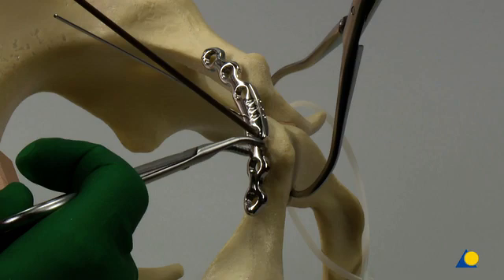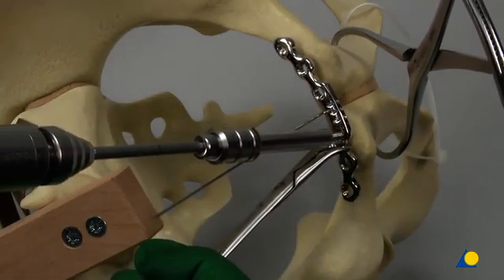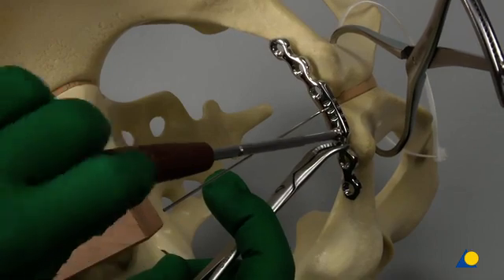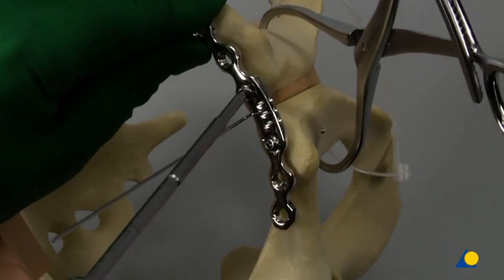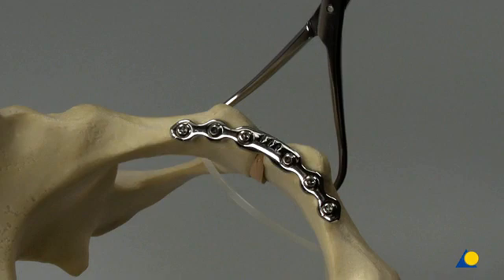In the frontal plane, the screw is directed slightly divergent. Palpation of the posterior aspect of the pubic body helps the spatial orientation of the drill bit. Insert the screw with the machine and tighten it by hand. Control the alignment of the plate with respect to both superior pubic branches before fully tightening the first screw and insertion of the second screw. Insert the second screw close to the pubic symphysis on the other side in a slightly eccentric position to compress the pubic symphysis. Complete the internal fixation of the pubic symphysis by insertion of the remaining four screws into the pubic branches.